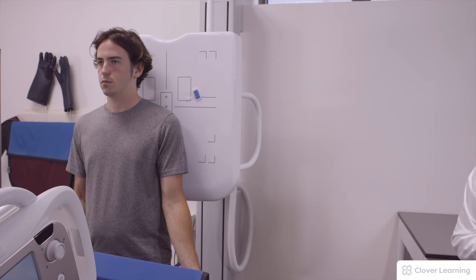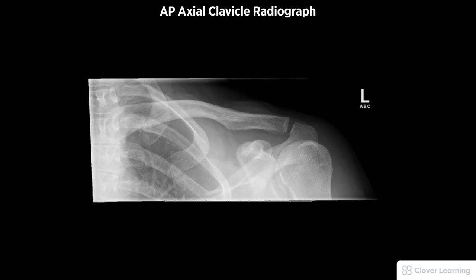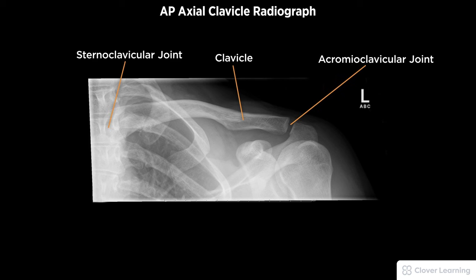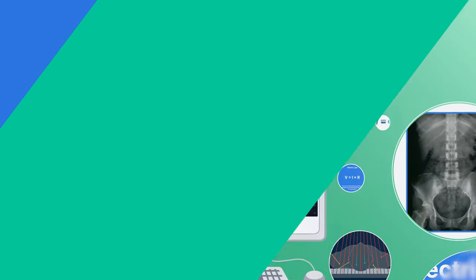The exposure is taken. A diagnostic AP axial clavicle radiograph must be free of motion and rotation. Demonstrated anatomy must include the entire clavicle, including the acromioclavicular and sternoclavicular joints, with proper visualization of bony detail.